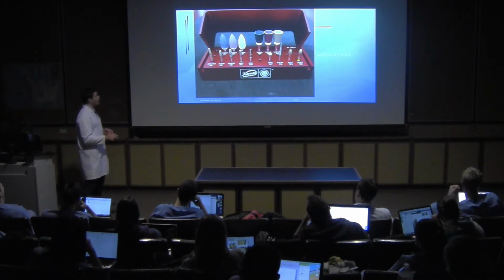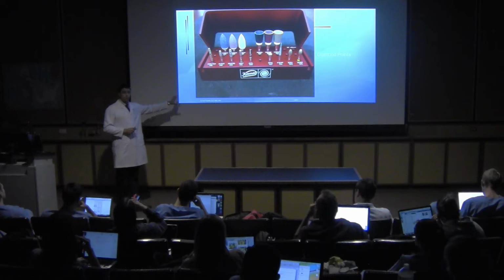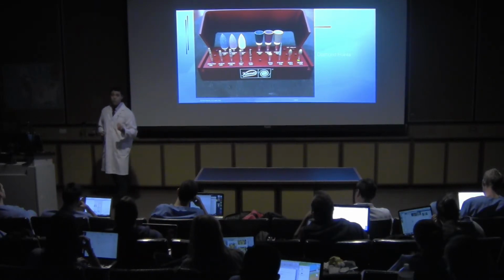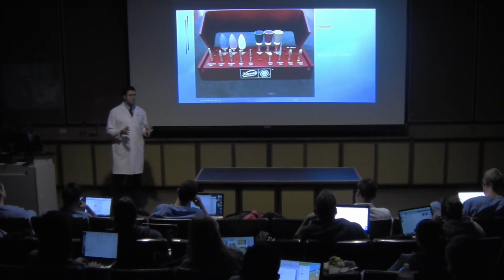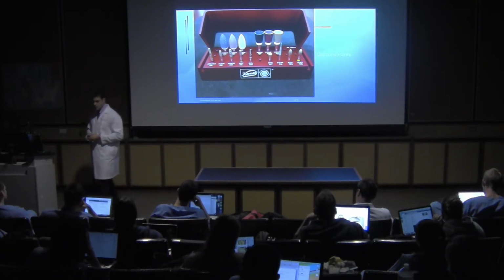The same thing with diamond points. The shape of the diamond point will give us the characteristics that we want in this prep. And we are going to see what are these characteristics that we must have to fit these restorations.